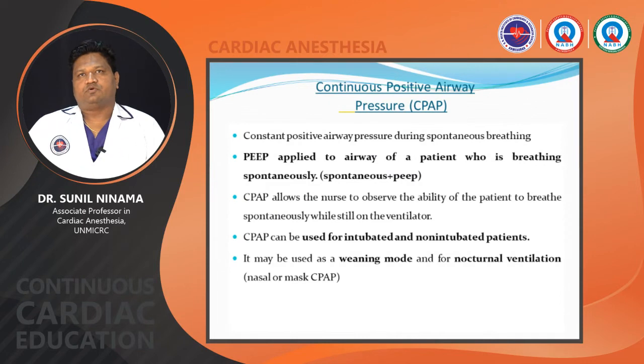What is continuous positive airway pressure? As its name suggests, it is a constant positive airway pressure during spontaneous breathing. The PEEP is applied to the airway of a patient who is breathing spontaneously. This is spontaneous breathing plus PEEP. CPAP allows the nurse to observe the ability of the patient to breathe spontaneously while still on the ventilator. CPAP can be used for intubated and non-intubated patients. It may be used as a weaning mode and for nocturnal ventilation, as nasal CPAP.